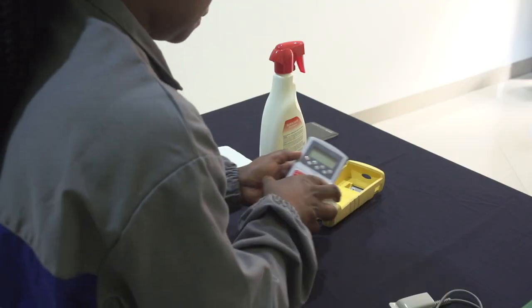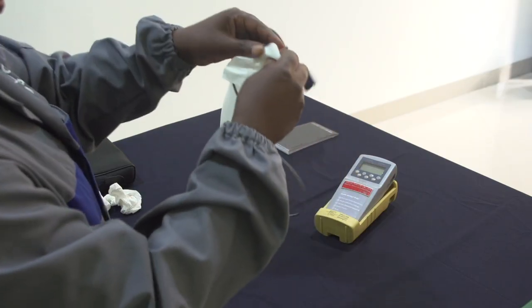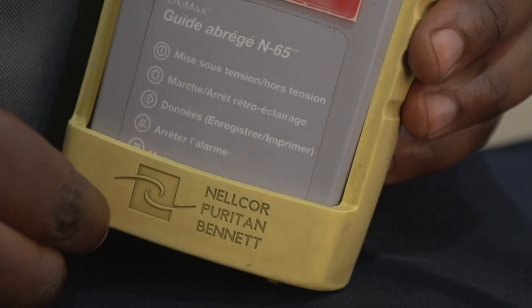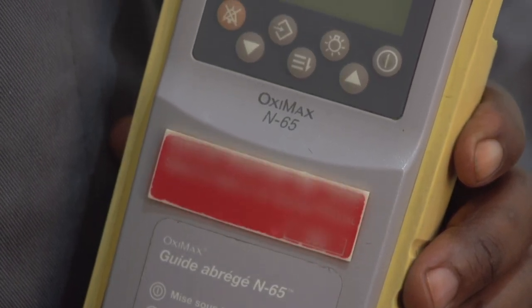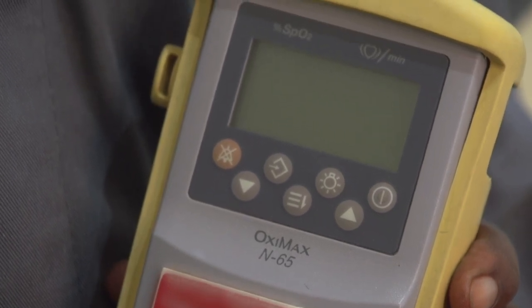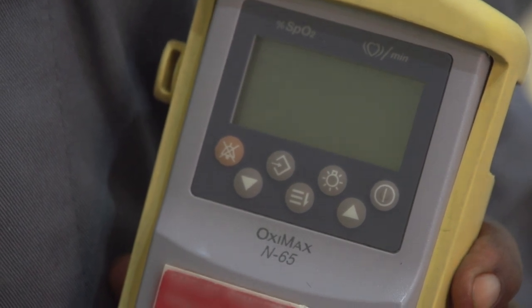On va vérifier l'état général de tous les câbles et les accessoires. On va ensuite vérifier la lisibilité de toutes les inscriptions. On vérifie l'existence et la lisibilité des étiquettes d'avertissement, des consignes d'utilisation et des inscriptions externes, telles que la marque, le modèle, le numéro d'inventaire, etc.